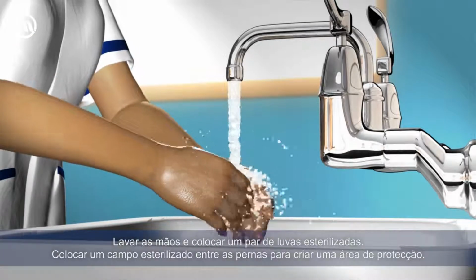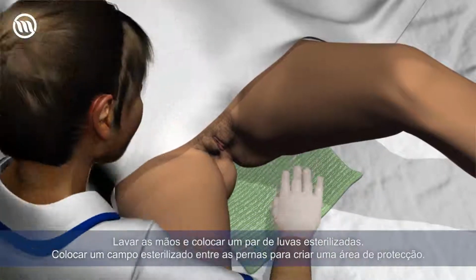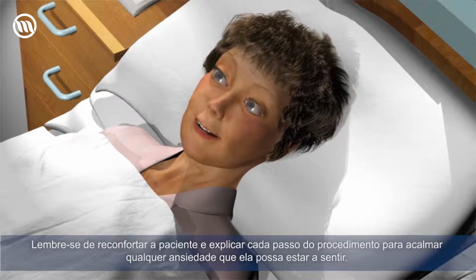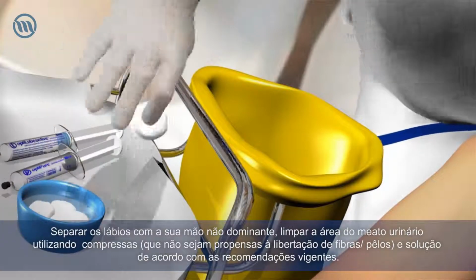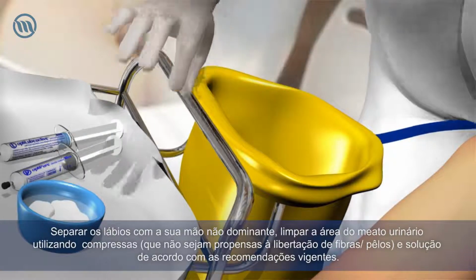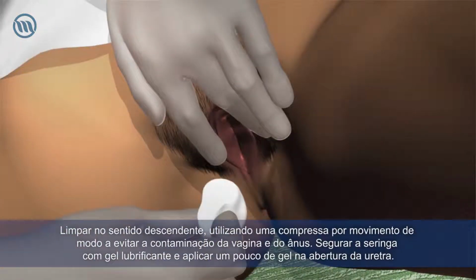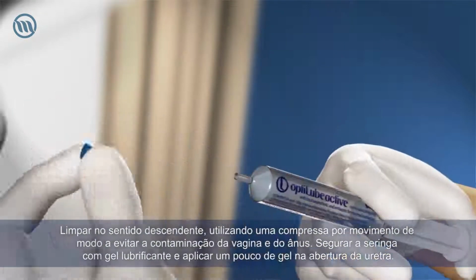Wash your hands and put on a pair of sterile gloves. Place a sterile towel between the legs to create a protective field. Remember to reassure the lady and explain each step of the procedure to ease any anxiety she may be feeling. Using low linting swabs, part the labia with your non-dominant hand and clean the meatal area using a solution according to your local policy. Wipe from top to bottom, using 1 swab per wipe to avoid contamination from the vagina and anus.